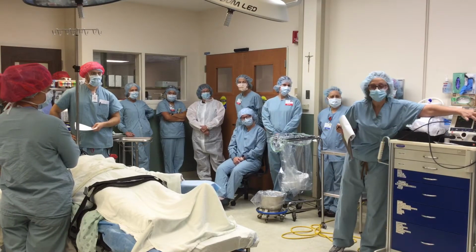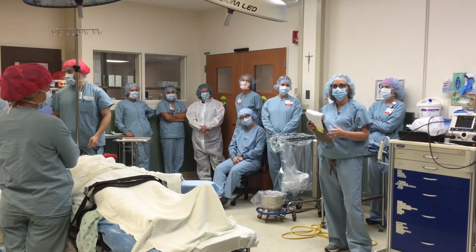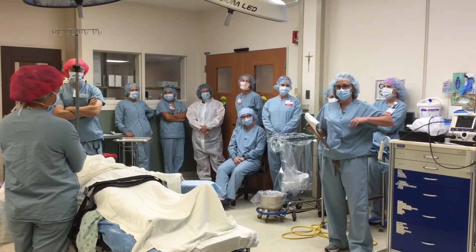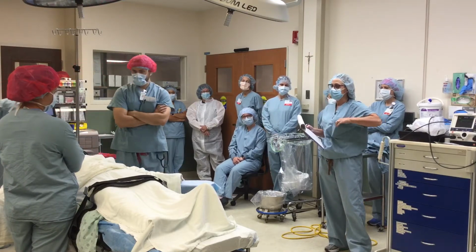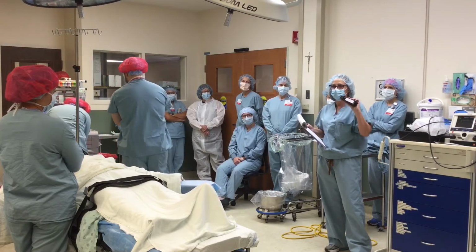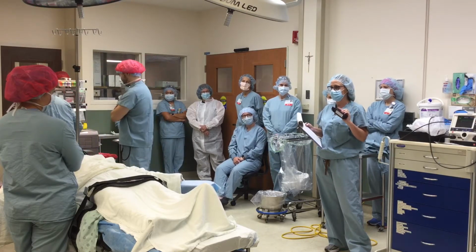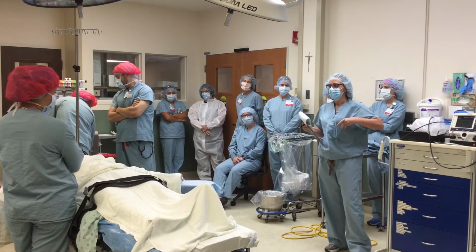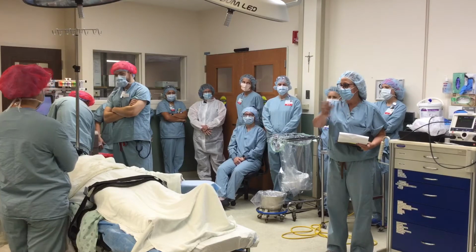We have the charge button and a defibrillator button. If the patient's in a shockable rhythm, meaning VTach or VFib, we're going to shock. I'm going to take this cord and put this on because this will absorb the shock, but we're going to actually charge and press the button to defibrillate if need be.